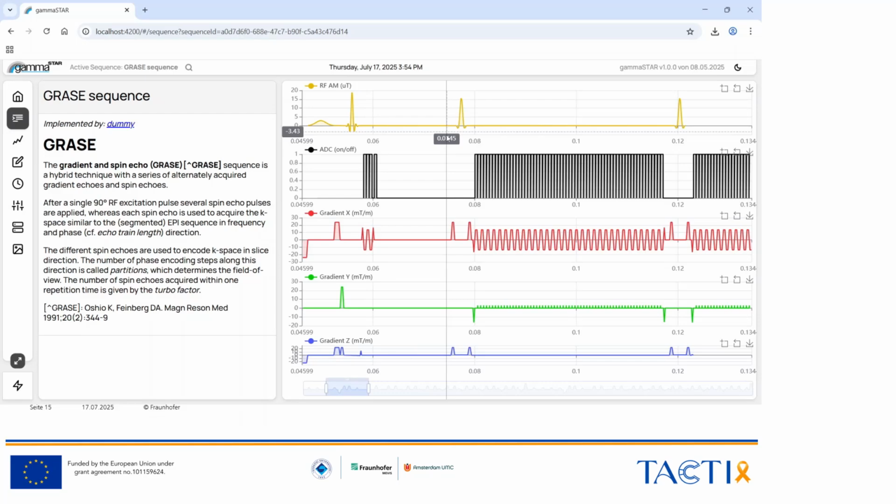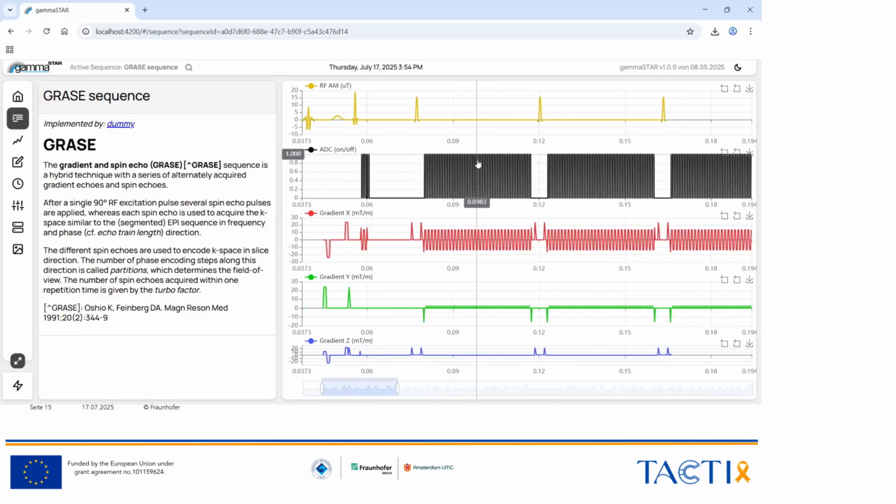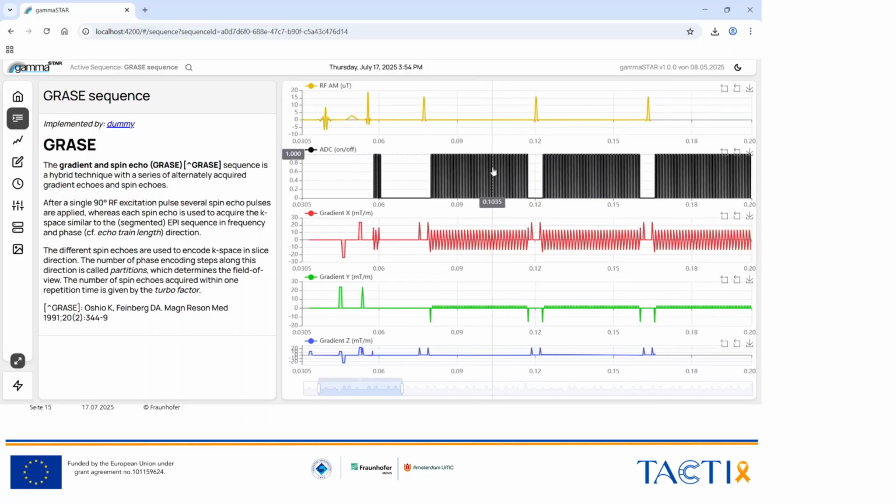And now we remember that there was this turbo spin echo sequence where we just utilize the signal that's still there, refocusing it again and getting a second echo here, a third one here. And the little trick that we are doing is that we acquire a 3D volume. So each of these EPI readouts is actually a 2D slice.